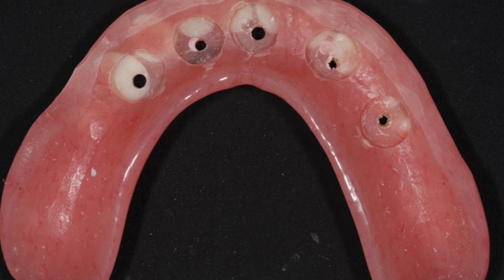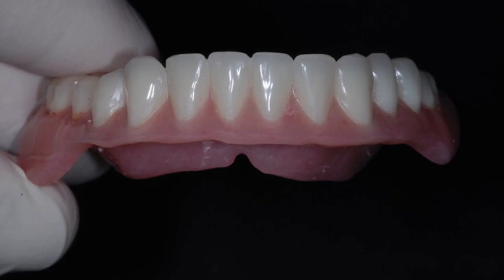And so they've just cut the housings out. They've given us a little bit of a hole in the occlusal aspect to let some of the excess flow out. So when that chair side material gets used to get the denture housing caps into that, it'll flow out onto the occlusal. Yes, we really don't want that to go underneath the abutment collar that they have to lock in.